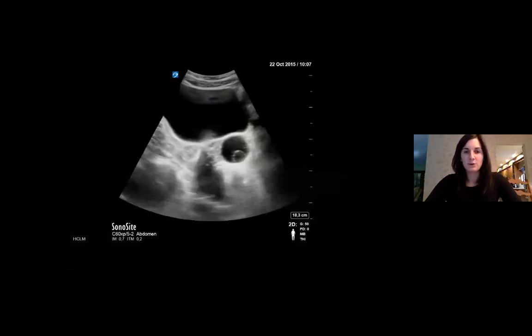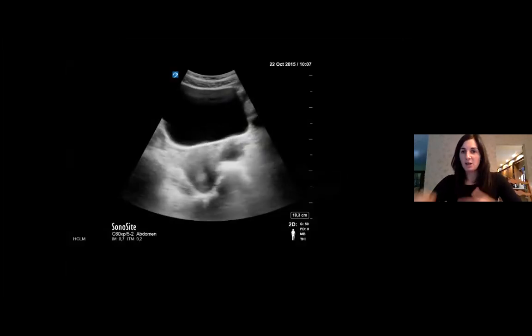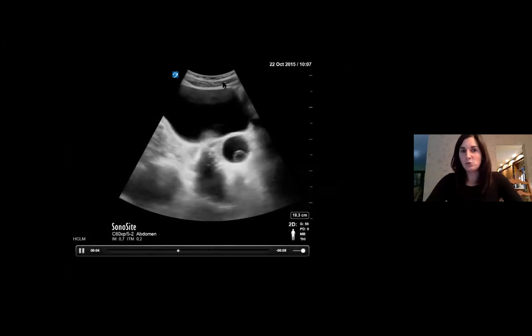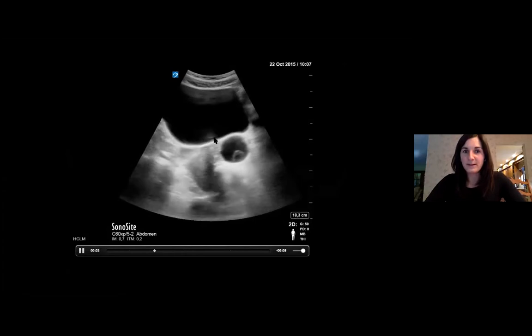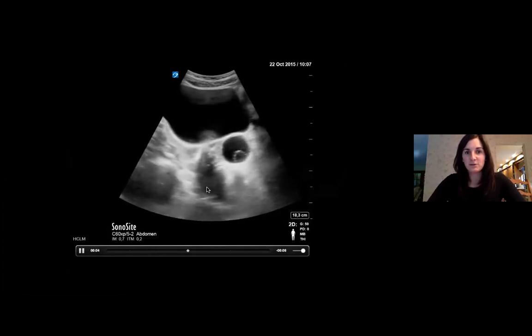Another patient, right lower quadrant pain, a little bit more adipose tissue, as you can appreciate up there. And sorry, let's say my screen is flipped. So you're putting your probe and then you're looking for those iliac vessels and you're not sure of the anatomy. And then you notice it. So this is bladder, if I can remind you. And here I'm trying to look at the uterus, but then I have this structure right here.